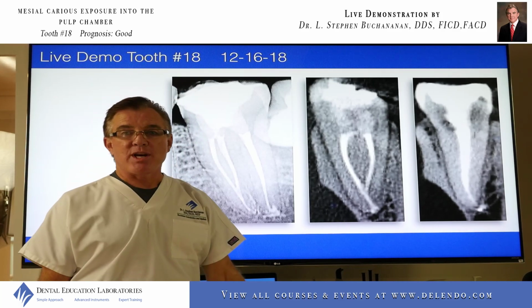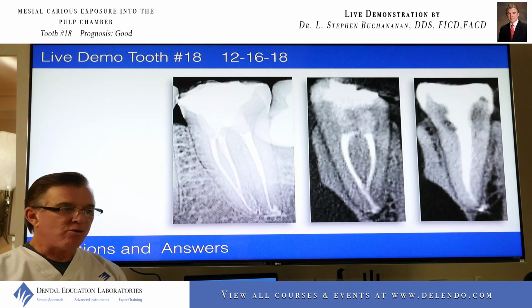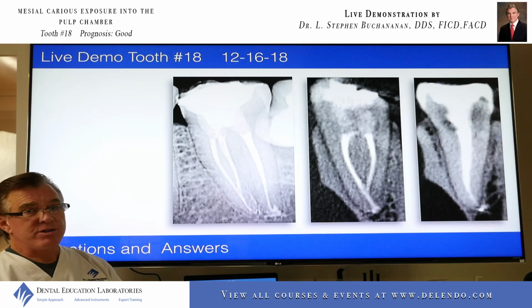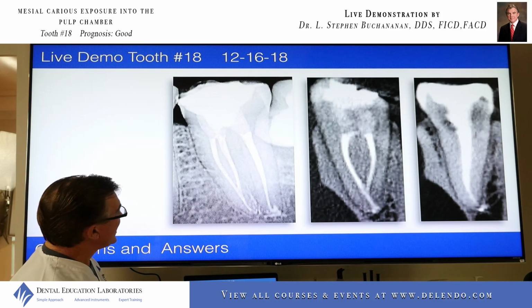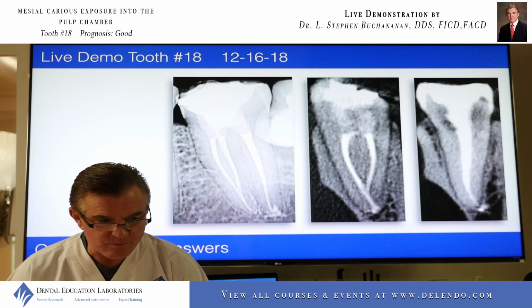I love taking post-op CTs. Tom McClammy is the one that got me interested in doing that. We take 40 by 40s on all of our final cases, our recalls, even our check visits sometimes. I think that's it for this case. So let's go over some of the questions. The questions were, as I said, really great.